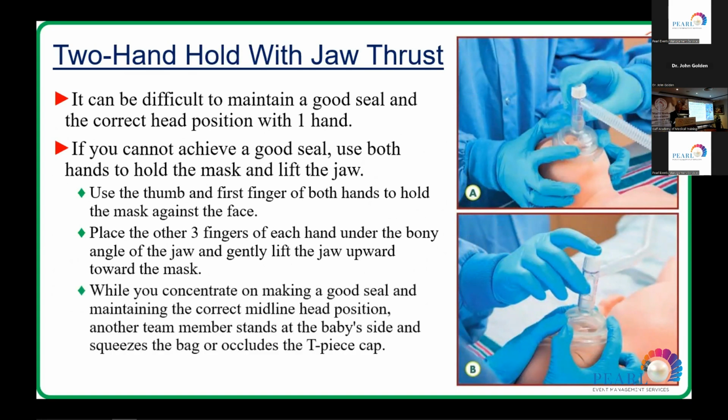While you concentrate on making a good seal and maintaining the correct midline head position, another team member stands at the baby's side and squeezes the bag or occludes the T-piece cap. A third person monitors the baby's response.